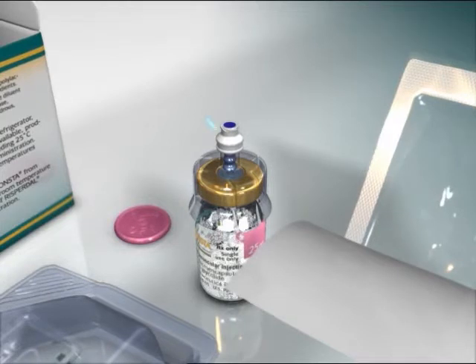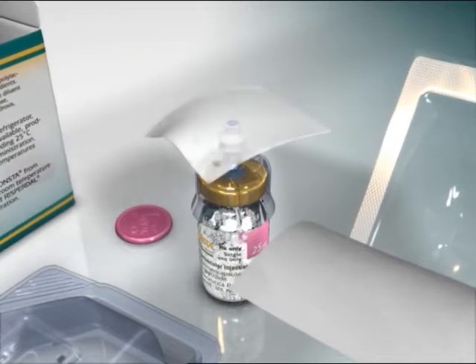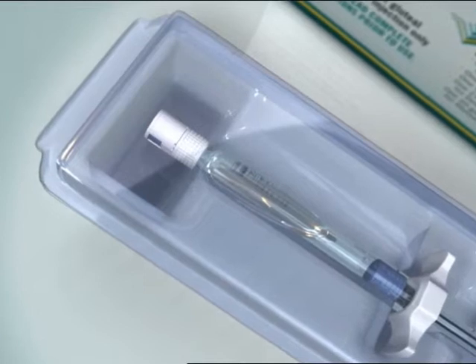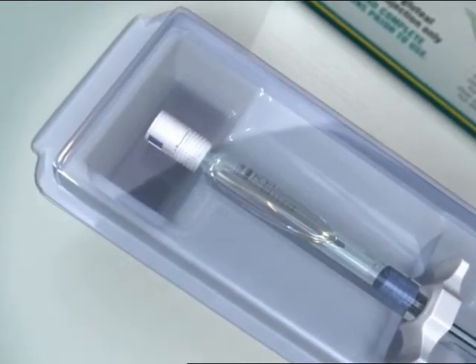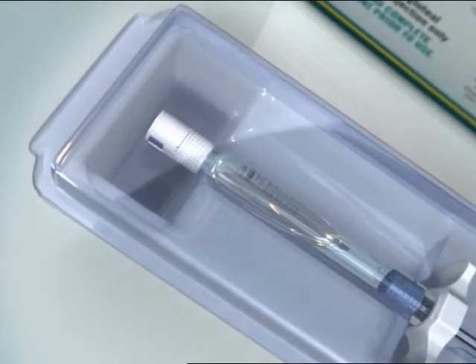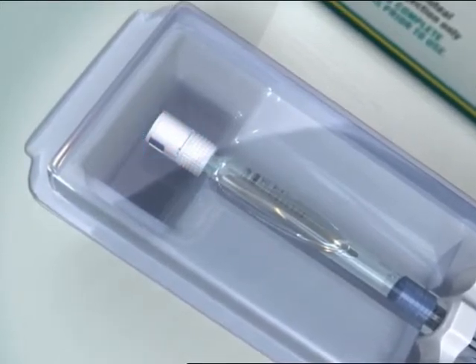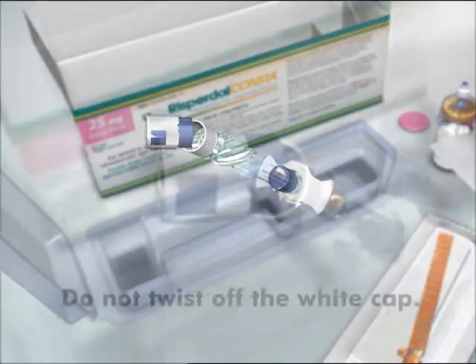Next, swab the syringe connection point of the SmartSight access device, identifiable by the blue circle, with your preferred antiseptic. Then attach the syringe to the SmartSight access device. The pre-filled syringe has a white tip consisting of two parts: a white collar and a smooth white cap. To open the syringe, hold the syringe by the white collar and snap off the smooth white cap.